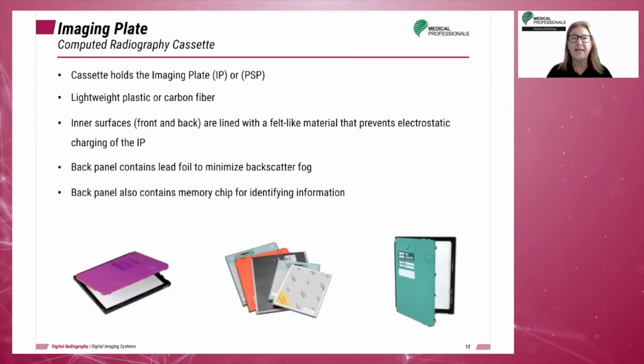The PSP, or imaging plate, is held in a cassette made of lightweight plastic or carbon fiber. The front and back are lined with felt-like material to prevent static buildup and dust collection.